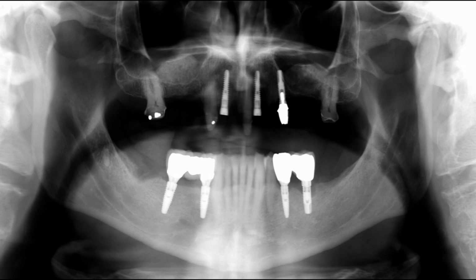We left teeth behind. I call this my transitional implant treatment, and I've described it in several other videos, but basically what it is, we try to give patients beautiful temporaries to leave here with, whether it's on teeth or implants. In this gentleman's case, the bone grafts needed to heal for 8 months, so we left 4 teeth and 1 implant to support the temporary while those bone grafts were healing. I placed 2 front implants to be prepared for the next surgery.